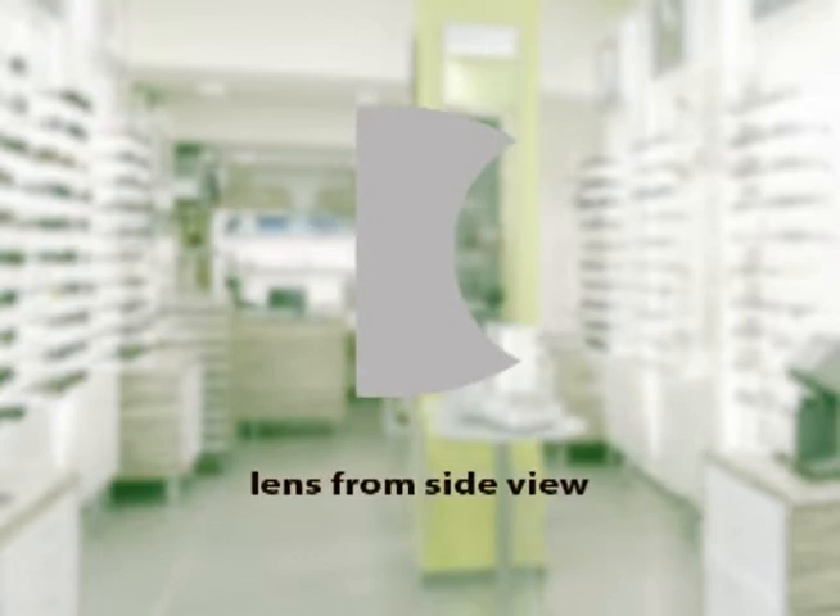Let's pick the lens material. There is high index, the thinnest lens we make; polycarbonate, a shatter-resistant thin lens; and standard plastic.